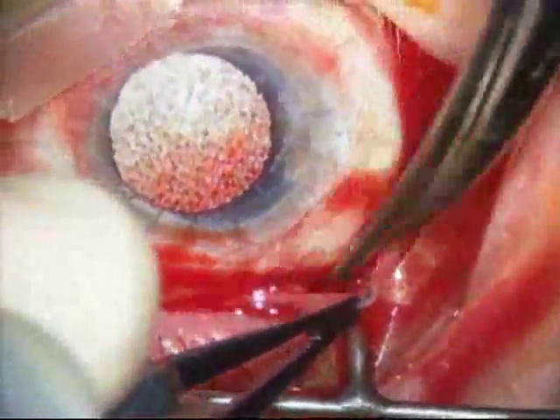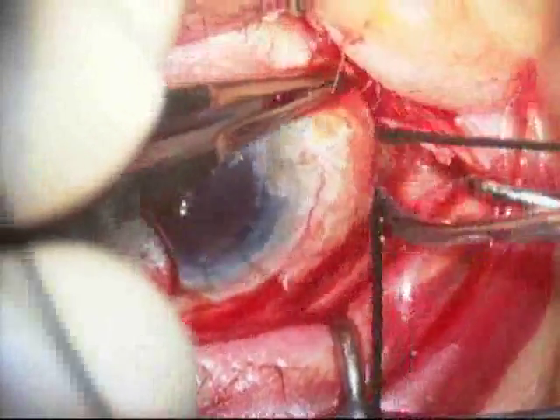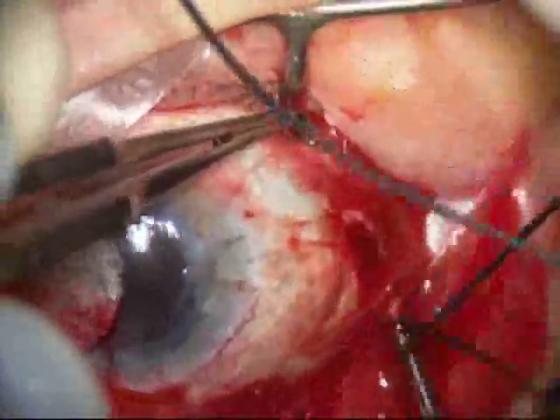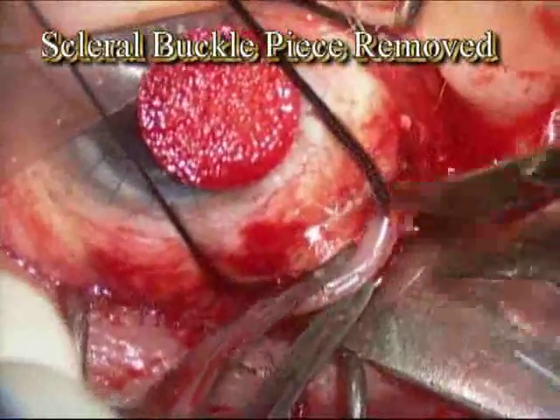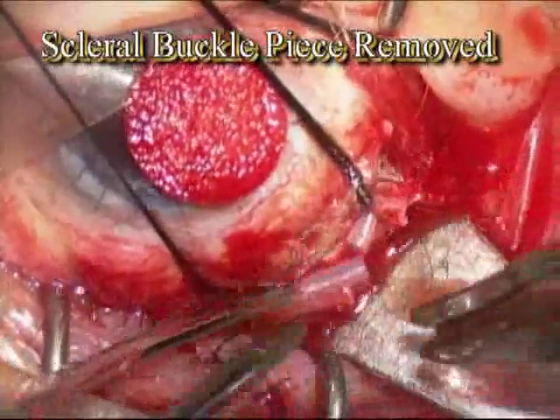Here you're seeing blunt dissection along the side of the globe and a silk tie being placed under the muscle. You'll also see the little silicone band which goes around the eye — that's the scleral buckle — and it is in the way of where the AMED valve will be placed. So a little piece of the scleral buckle is removed, just enough to make room for the AMED valve.